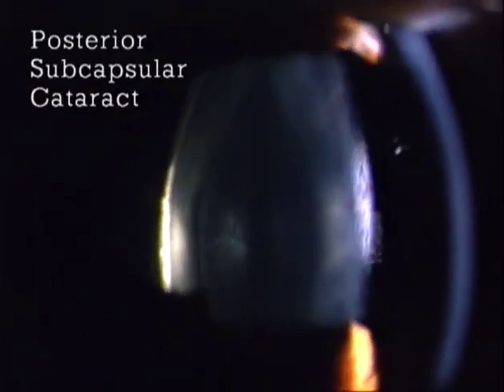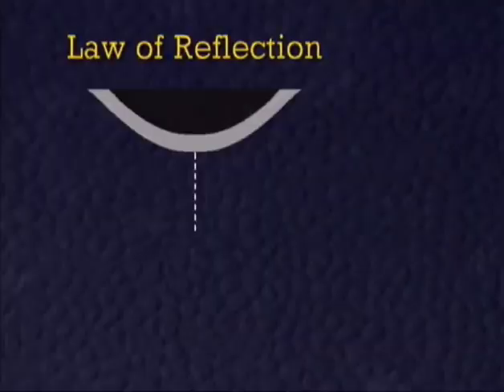On the other hand, in this case of a posterior subcapsular cataract, there are lesions which, as the higher magnification shows clearly, disturb the reflex of the posterior lens surface. Therefore, the lesions must be in front of the capsule, that is, they are situated in the posterior lens cortex.